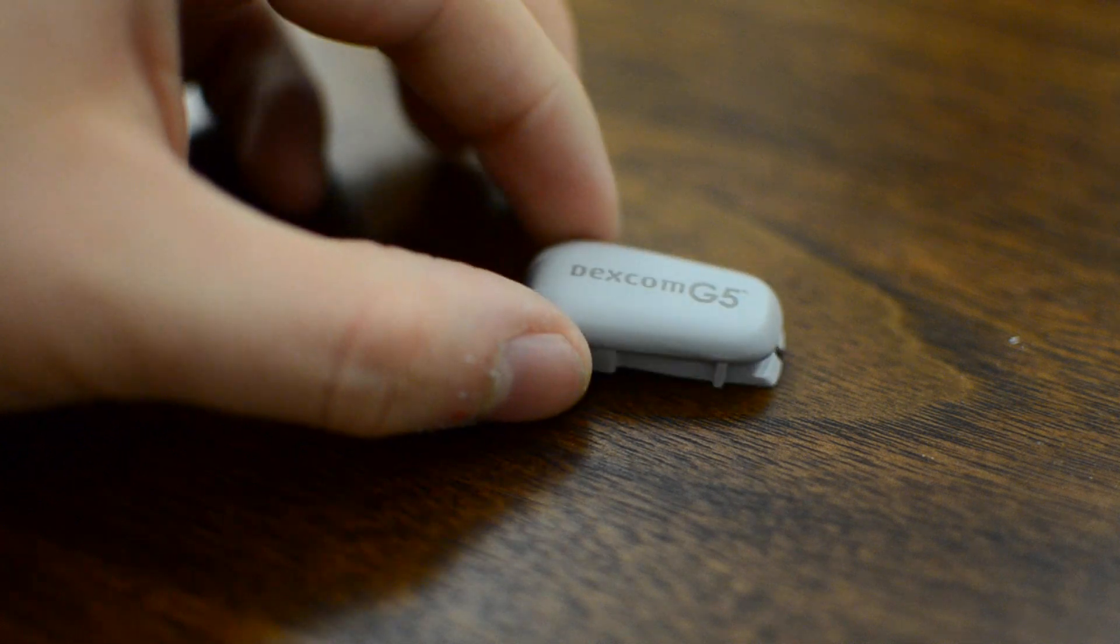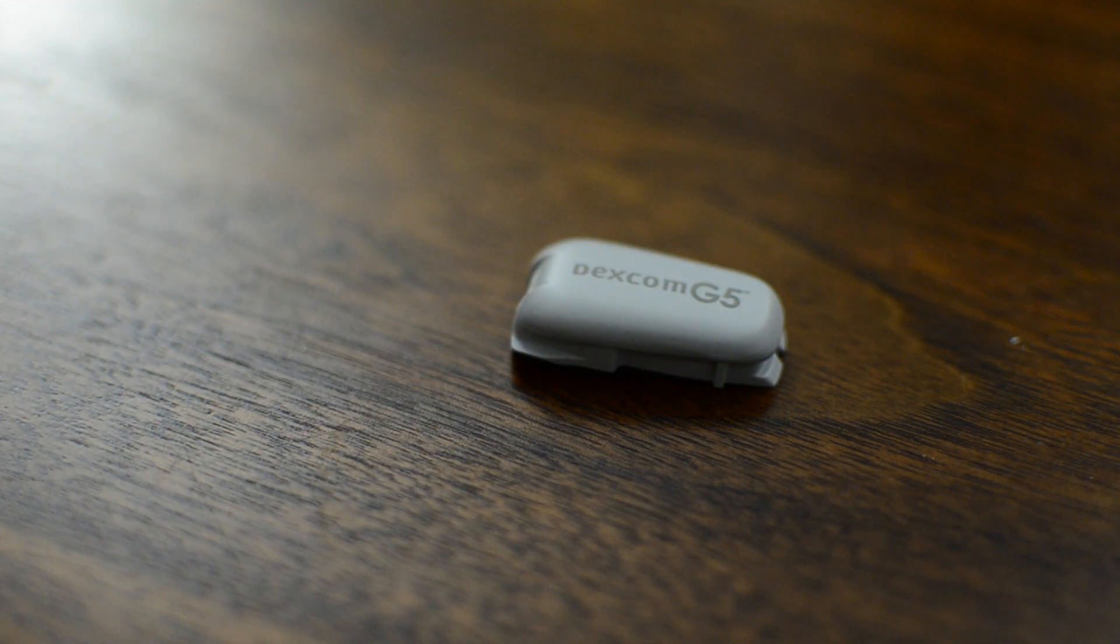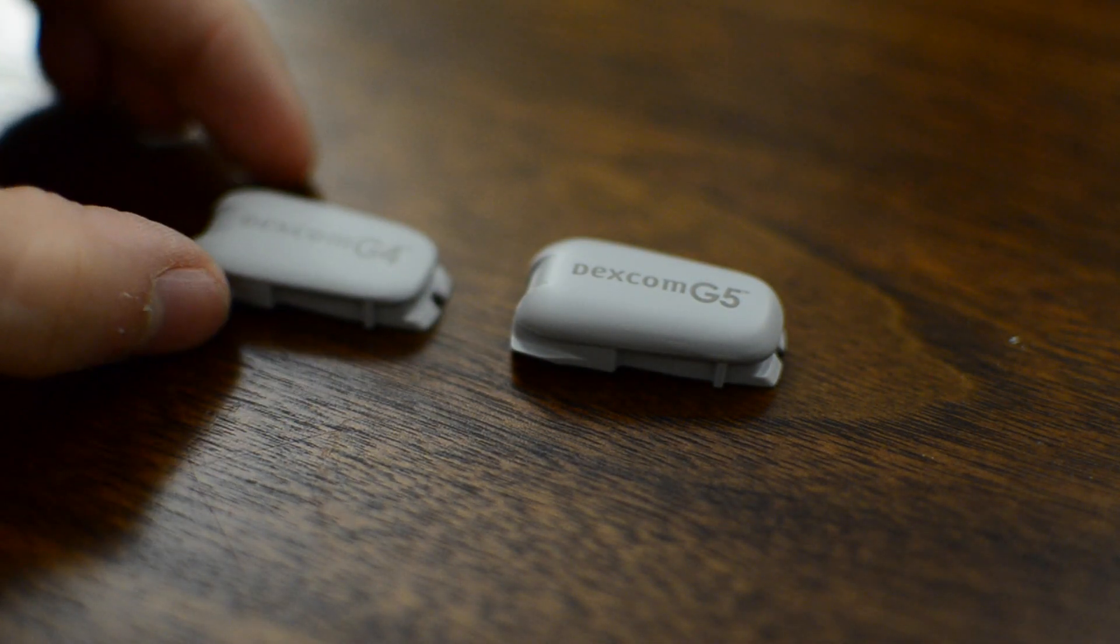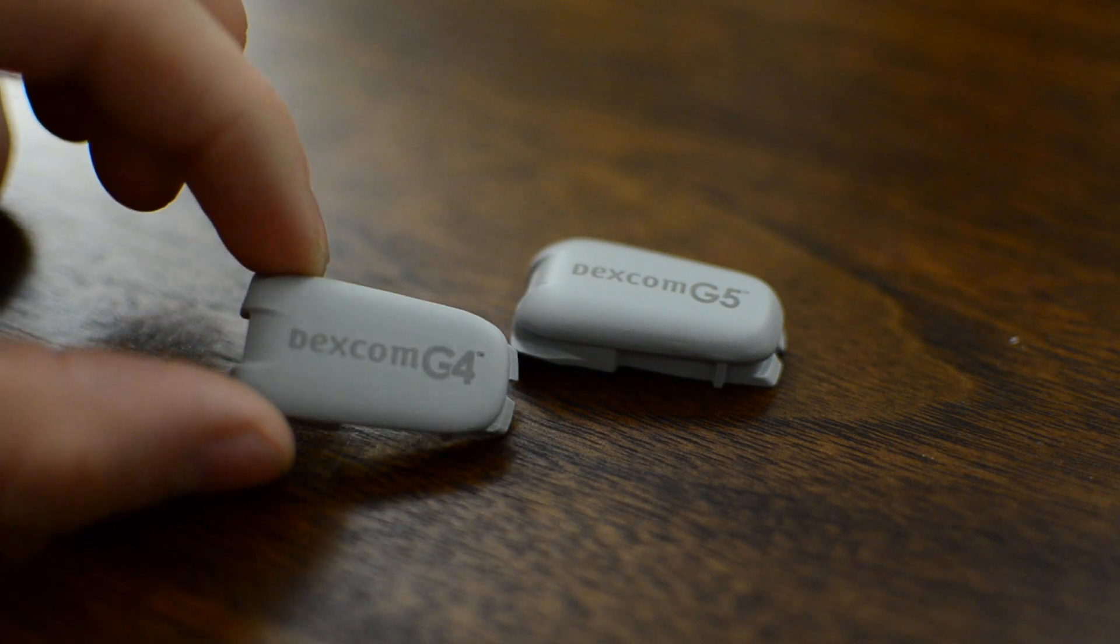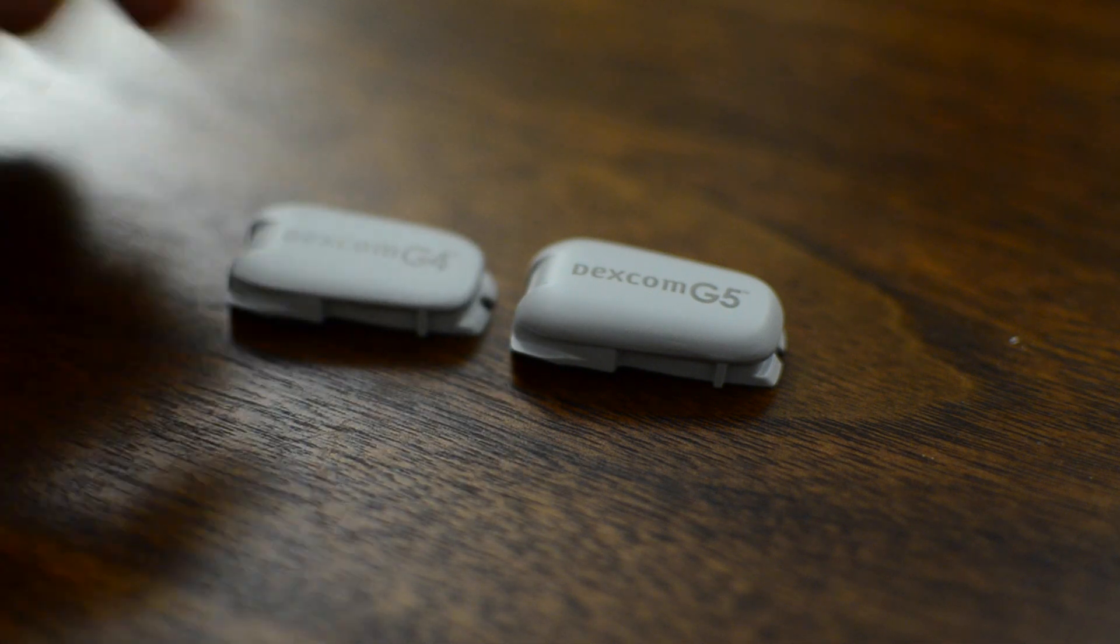So if we look at the sensor itself, you first may notice it's a little bit chunkier than the last generation G4. Other than that though, it's pretty much the same size. It still uses the same sets that we had last time. If we compare them side by side, you can basically see it's just a bit taller.